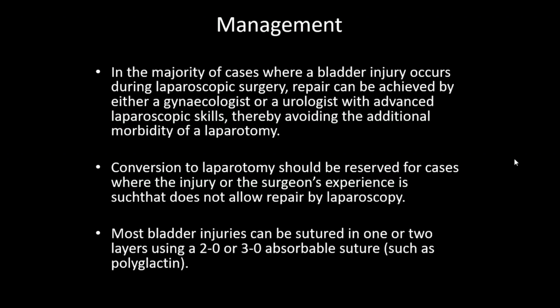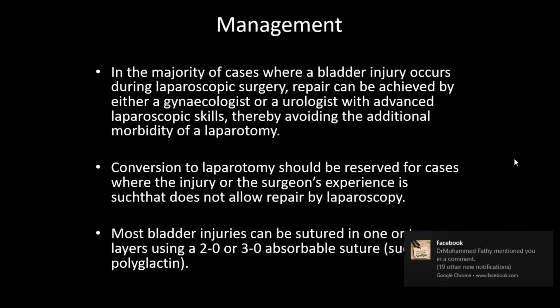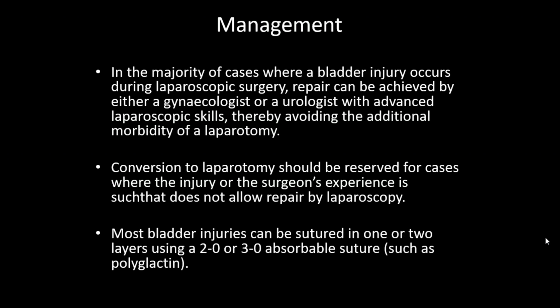So what I said last: cystoureterography. If the image is taken by plain X-ray, it will be a retrograde cystoureterography. Ideally, CT imaging with contrast is ideal. So CT cystoureterography is the CT urogram, and this is the best option to visualize the ureters.